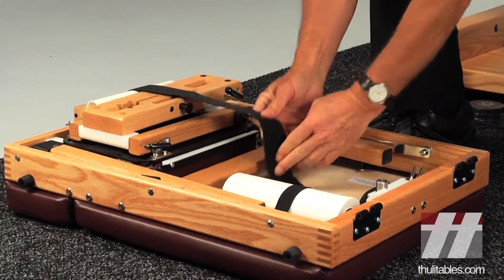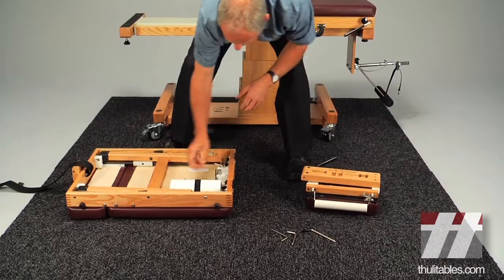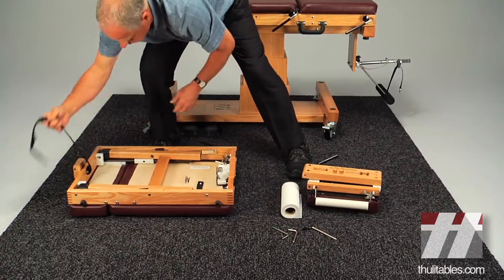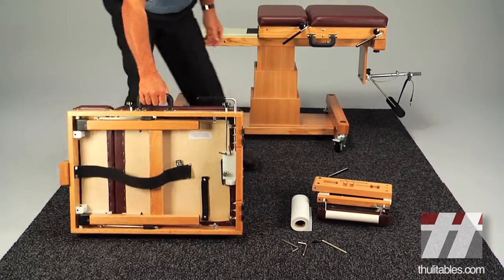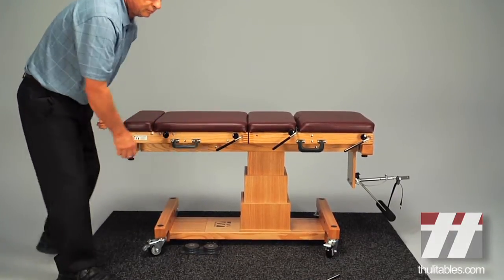Remove the headpiece from the back half of the table and set it aside. Return the velcro strap to its storage position. Mount the back half of the table to the conversion base and line up the hinges with those of the front half.